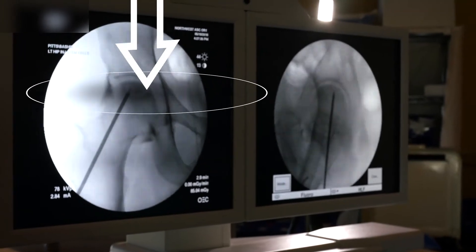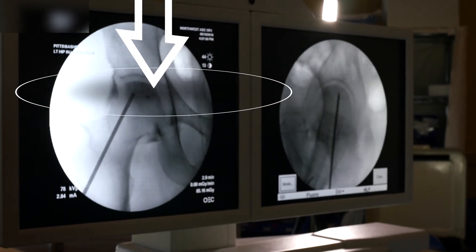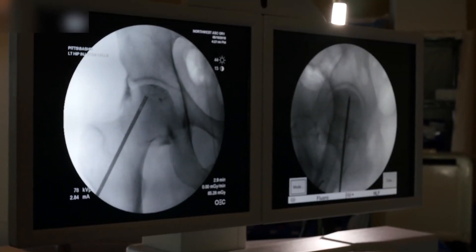Wow, that's really filling. See that? That's perfect — directly in the lesion.